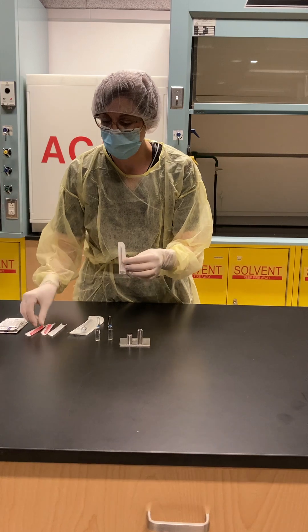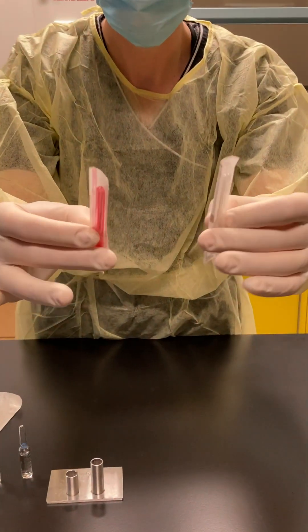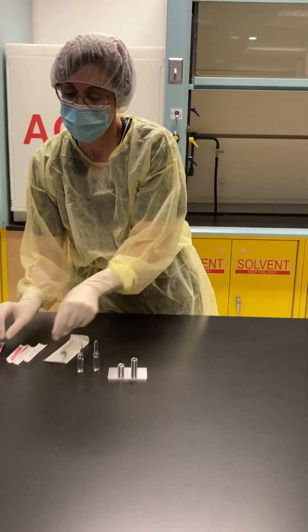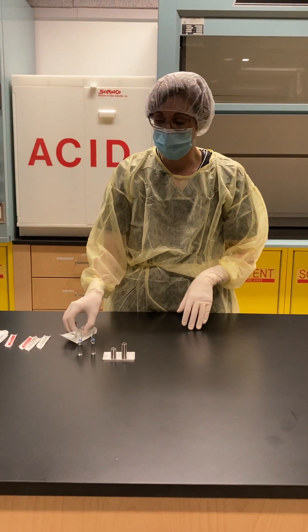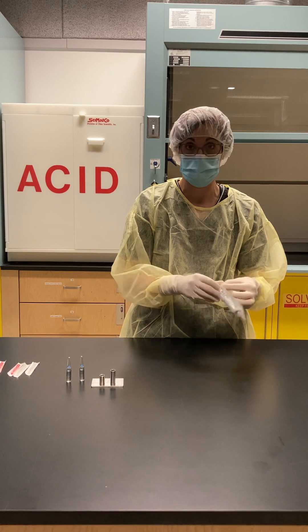As you can see, filter needles look different than a regular blunt needle. The first thing I'm going to do is attach my filter needle to my syringe, as this will prevent any possible glass contamination.